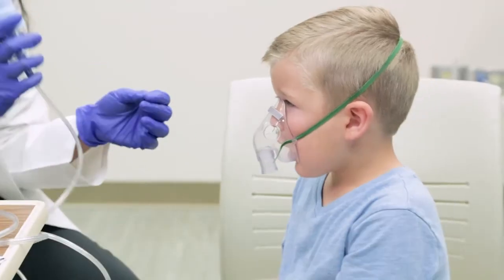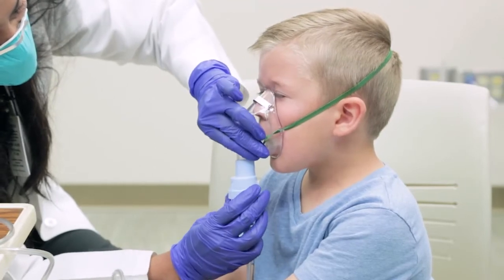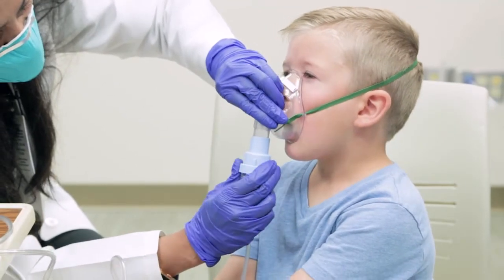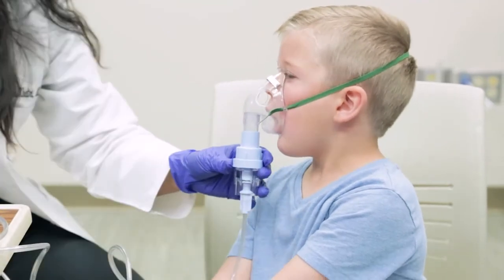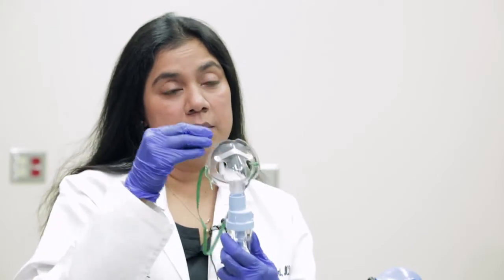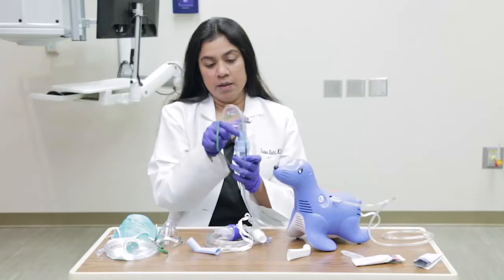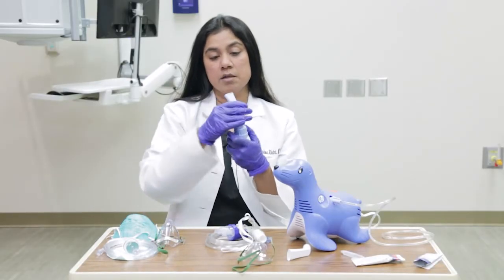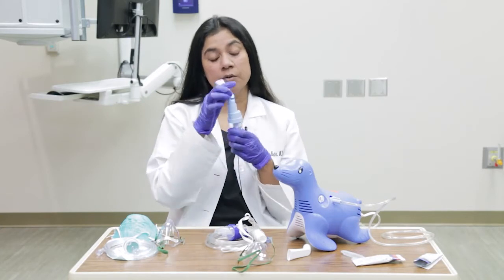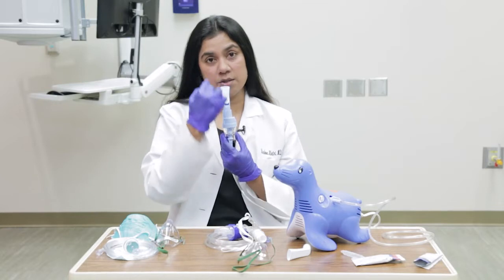The next step is to make sure this is connected to the mask — put it in right there, just like that. Does that feel okay? Let me turn it on. You'll see that this liquid is turning into a mist. If it's correctly fitted, you'll see that the mist is not coming out from the sides of the mask. If you have a mouthpiece, this will go inside the child's mouth, and again you'll see that the liquid is changing into a mist going into the child's mouth.